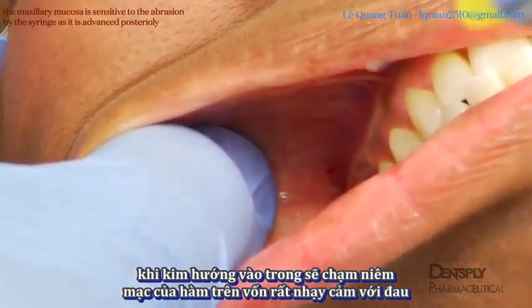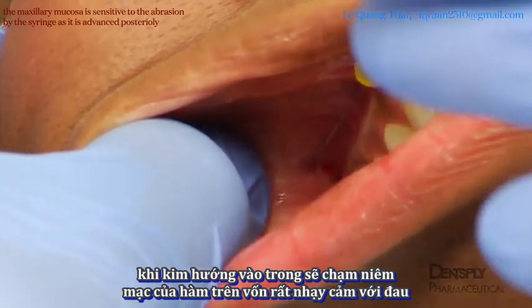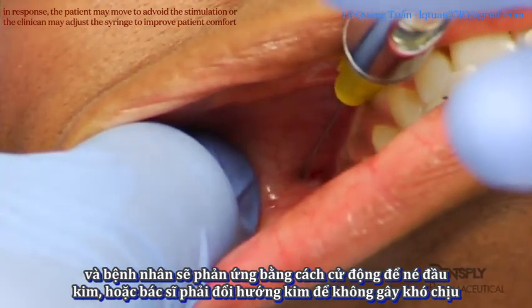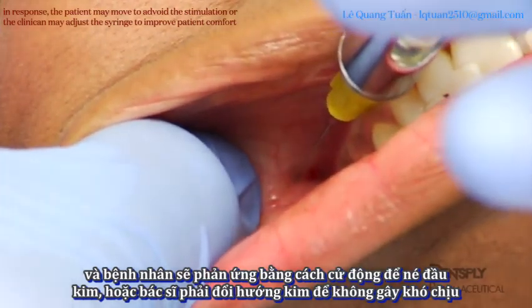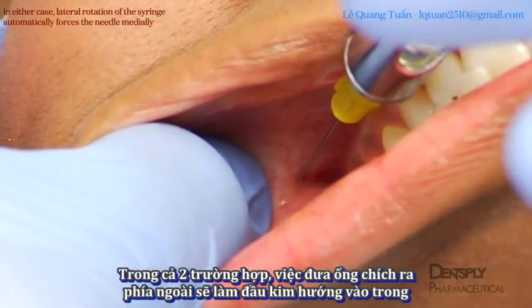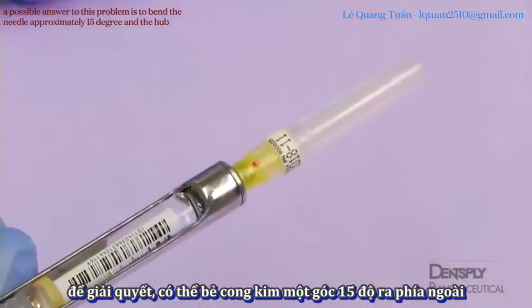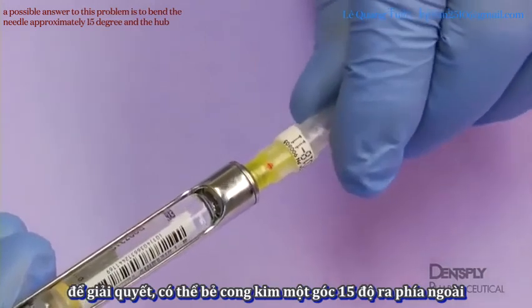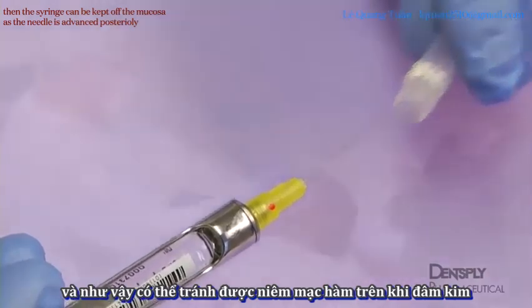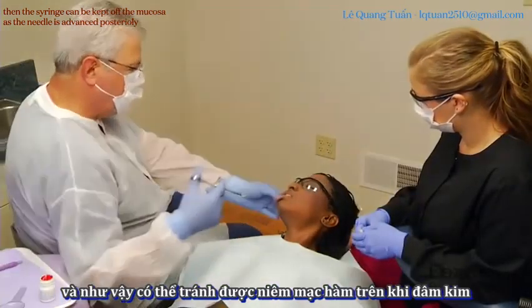The maxillary mucosa is sensitive to abrasion by the syringe as it is advanced posteriorly. In response, the patient may move to avoid the stimulation, or the clinician may adjust the syringe to improve patient comfort. In either case, lateral rotation of the syringe automatically forces the needle medially. A possible answer to this problem is to bend the needle approximately 15 degrees at the hub. Then the syringe can be kept off the mucosa as the needle is advanced posteriorly.